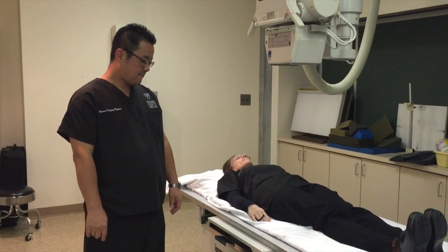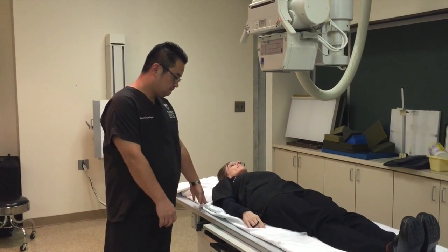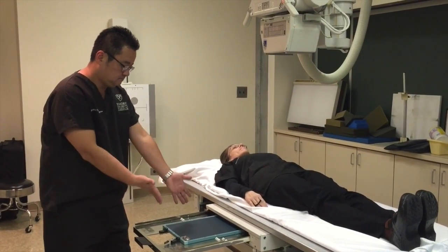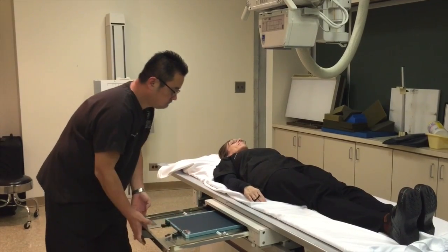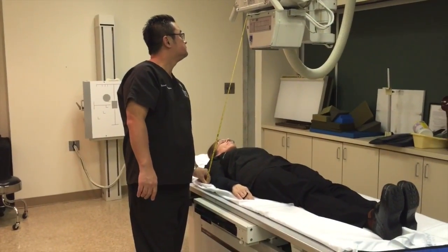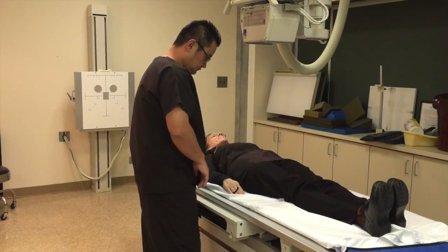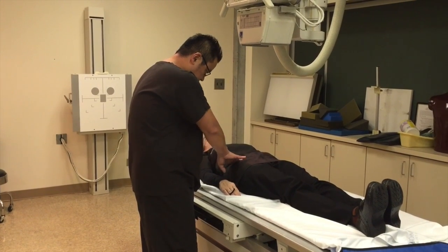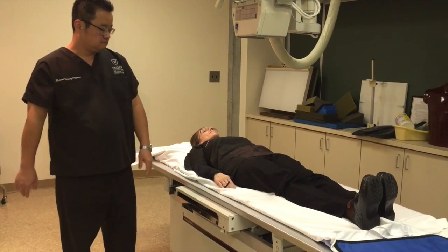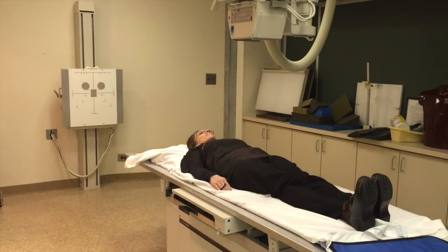Lastly, the tech will take a post-void bladder shot. With the patient supine, the technologist will place a 10 by 12 IR crosswise with the right marker in the bottom corner. He will set an SID of 40 inches and set up a central ray two inches below the ASIS and at the mid-sagittal plane. The technologist will set technical factors of 80 kVp and 25 mAs.